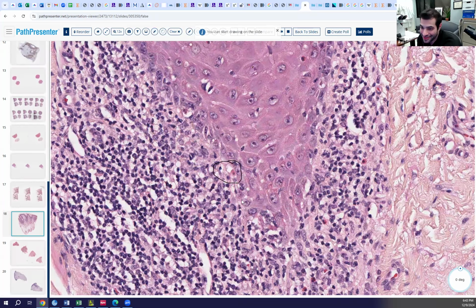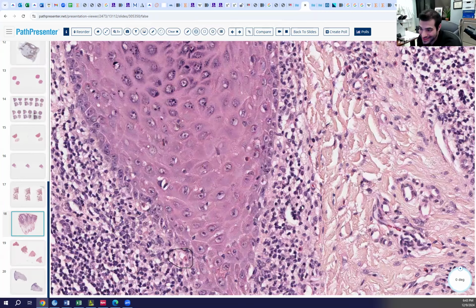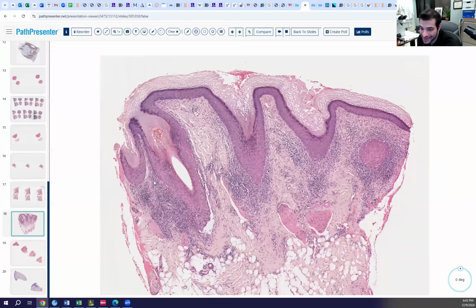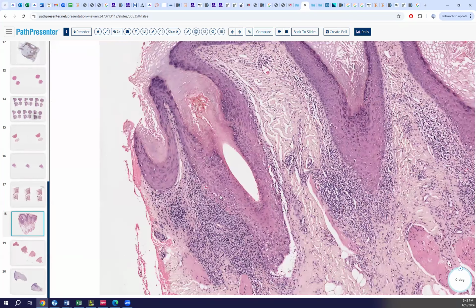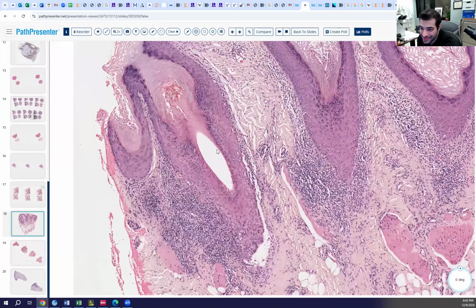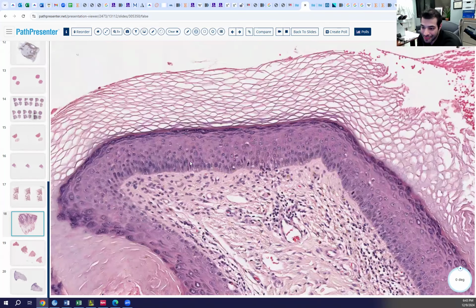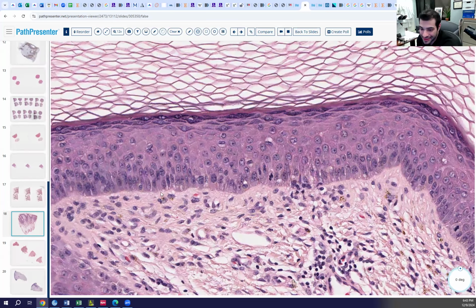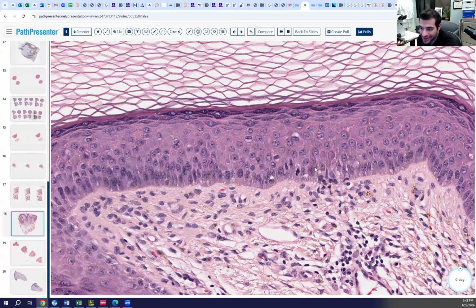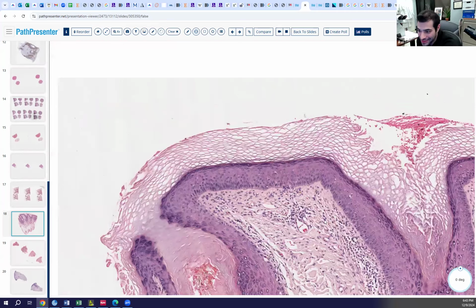And there's evacuation of the follicle. Where is the inflammation? More superficial, so like the infundibulum area. Yeah. This is not one of those super rare cases where we also have involvement of the non-follicular epidermis, fortunately.